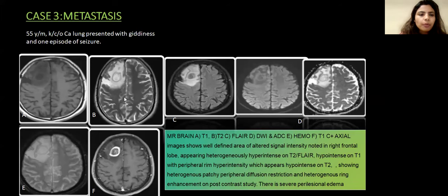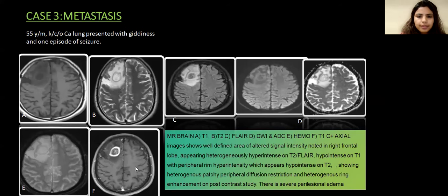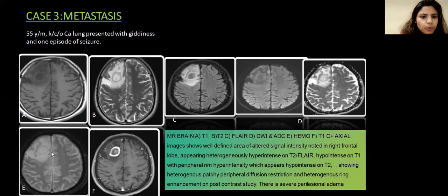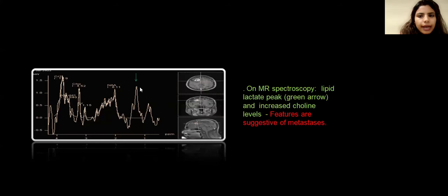Next case: 55-year-old male patient, a known case of CA lung, presented with giddiness and one episode of seizure. MR brain T1, T2, FLAIR, diffusion-weighted, hemosequence, and post-contrast axial images showing a well-defined altered signal intensity lesion in the right frontal lobe, appearing heterogeneously hyperintense on T2 and FLAIR, hypointense on T1 with a peripheral T2 and T1 hyperintense rim, showing heterogeneous patchy diffusion restriction, no blooming on hemosequences, and ring enhancement on post-contrast images. On MR spectroscopy, there is a lipid lactate peak and increased choline peak, suggestive of metastasis.